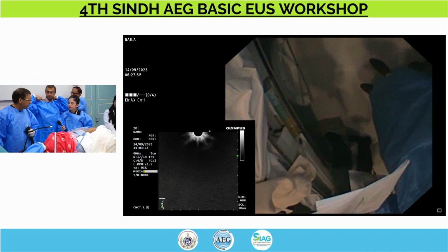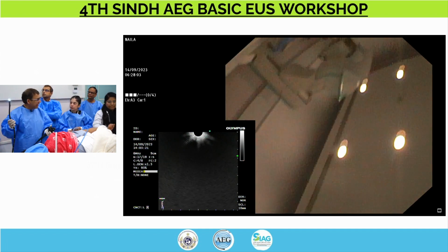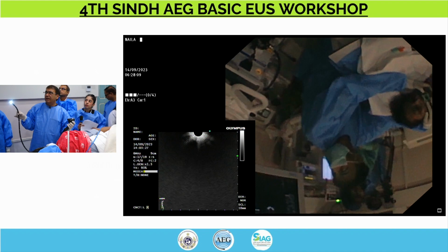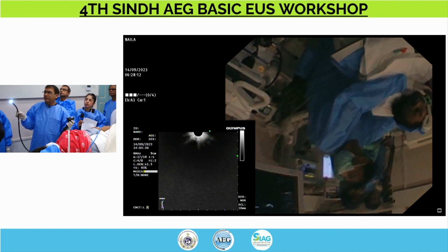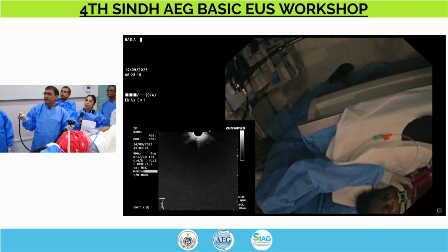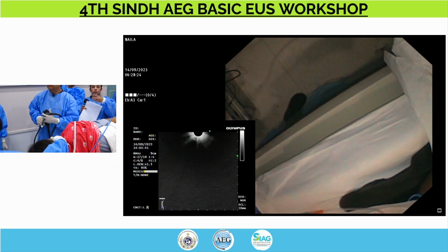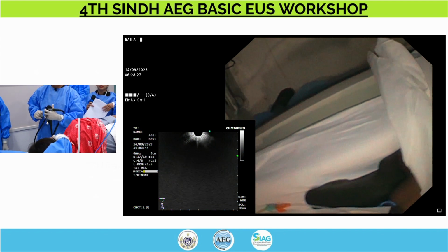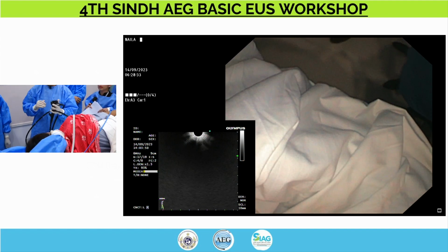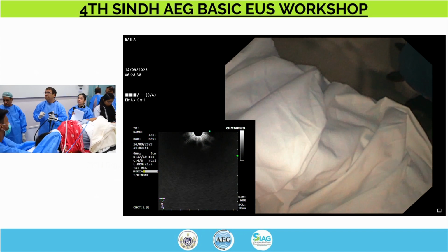Okay. Thank you. We have a stent in there, right? You said? We do. Okay. So can we just put the camera on endoscope? If you can change everything there, we don't need the EUS screen yet. Just on the camera, just on me. Camera just on the scope, please. Can we enlarge that image? The image that Dr. Hassan is on? Complete view. Just trying to get your image enlarged so we can see better here.